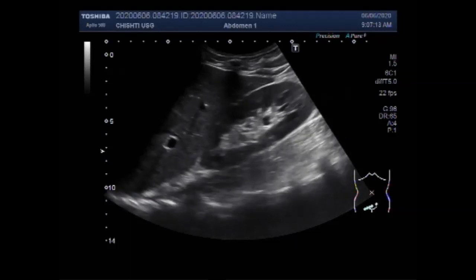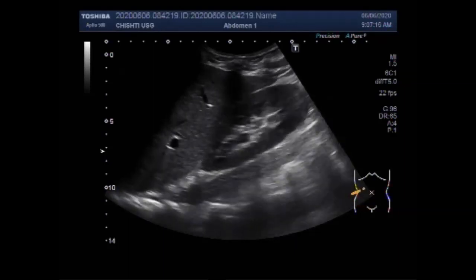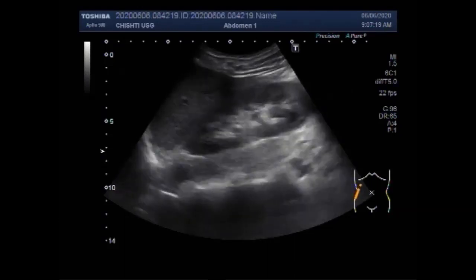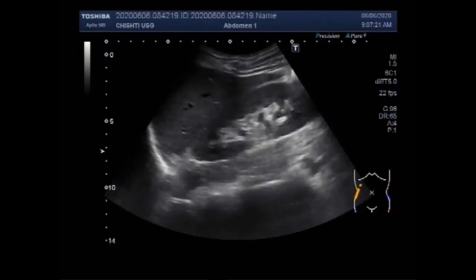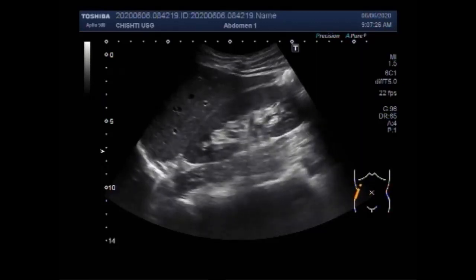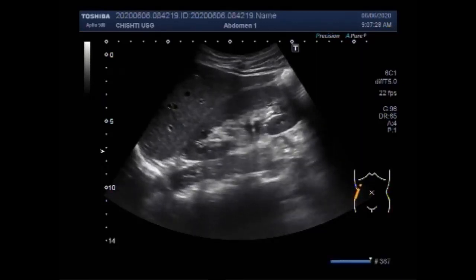This ultrasound video shows a stone in the ureter and diverticulum of the urinary bladder. You can see the right kidney and it shows minimum to mild hydronephrosis with minimum hydroureter. As you will see in the later part of this video, the size of the stone is very small and the stone lies in the distal portion of the ureter.